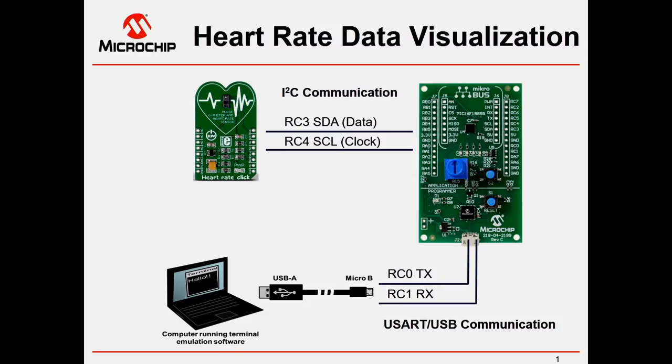I do have a little diagram here that I can talk about, and that will give us a very good understanding of how the demo is going to look and everything. So we do have, you guys can see this MPLAB Xpress evaluation board to the right, and this board has the Mikroelektronika bus. So using a Mikroelektronika click board, which we're going to be using today, is the Heart Rate click. That's going to plug in directly to the board, and remember, guys, this is just one of the demos that we're doing, right?